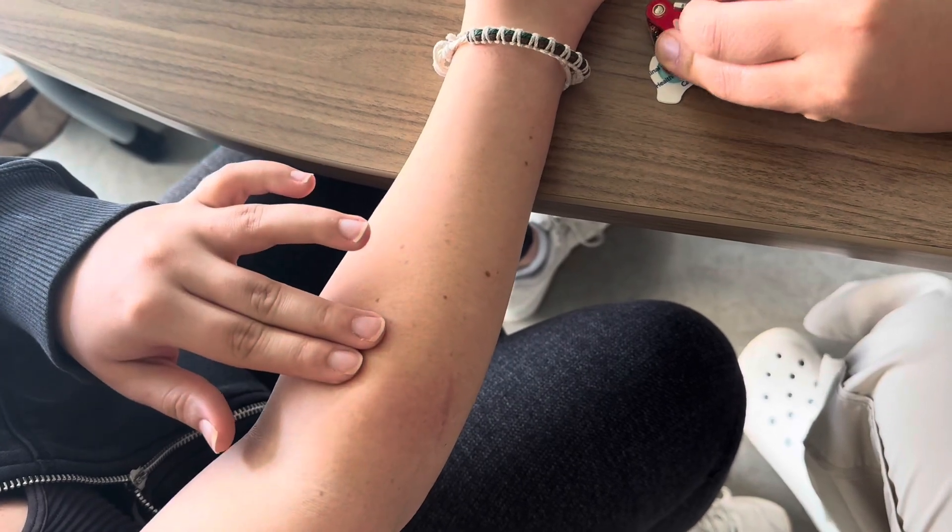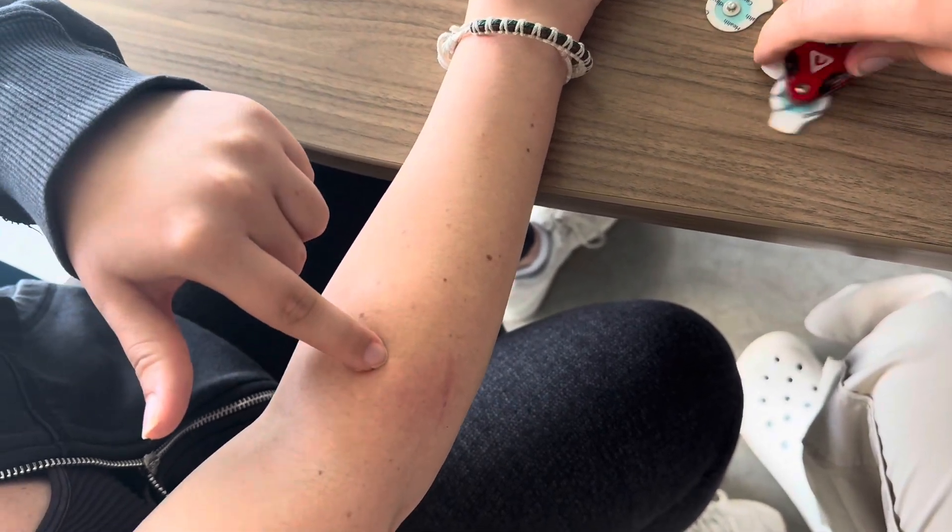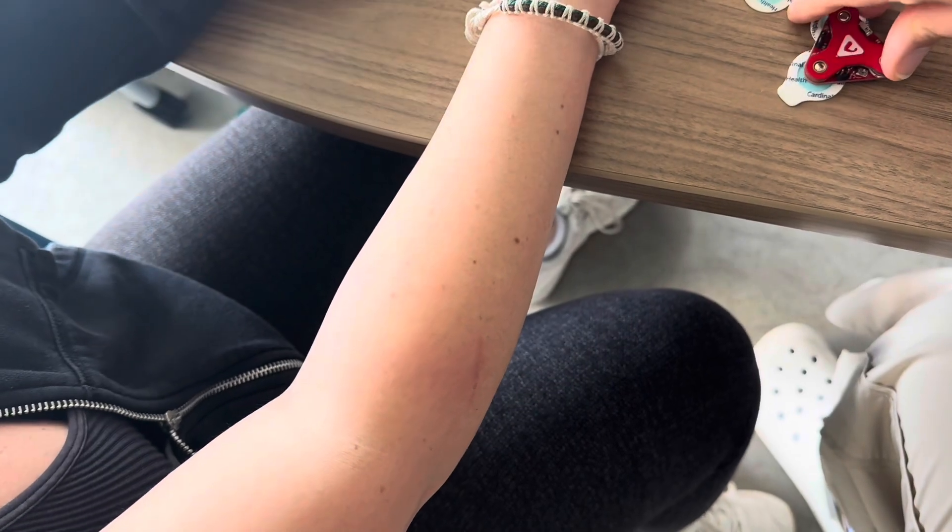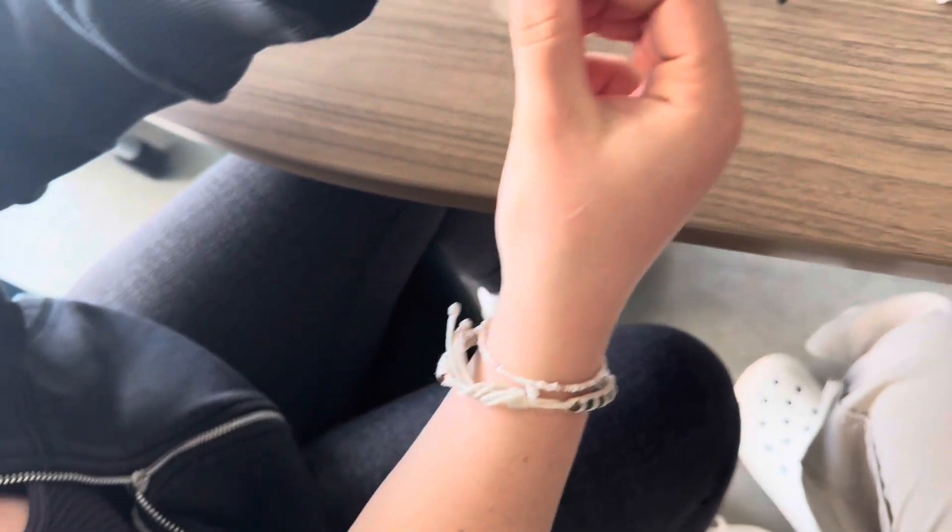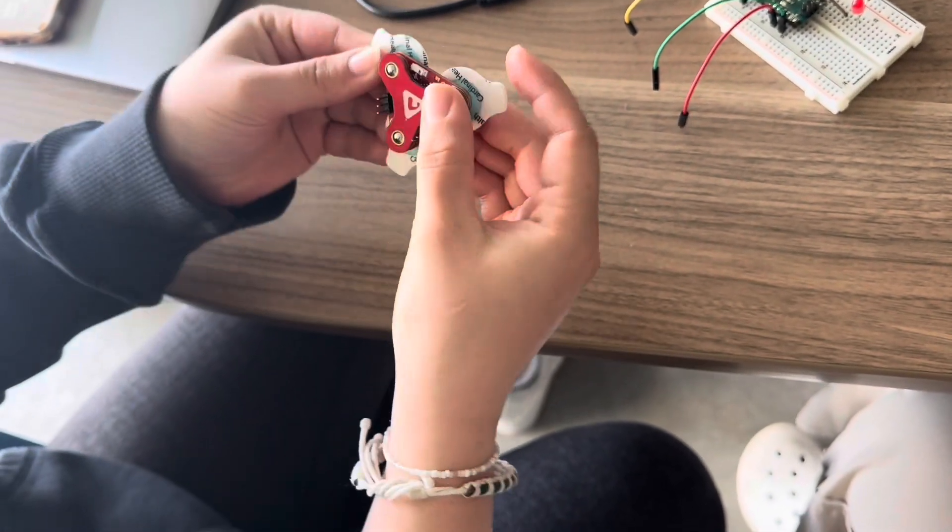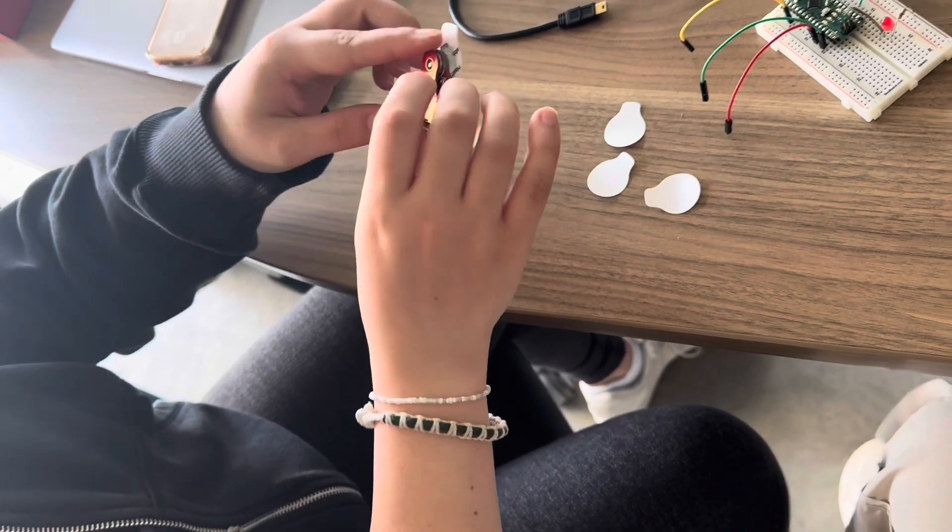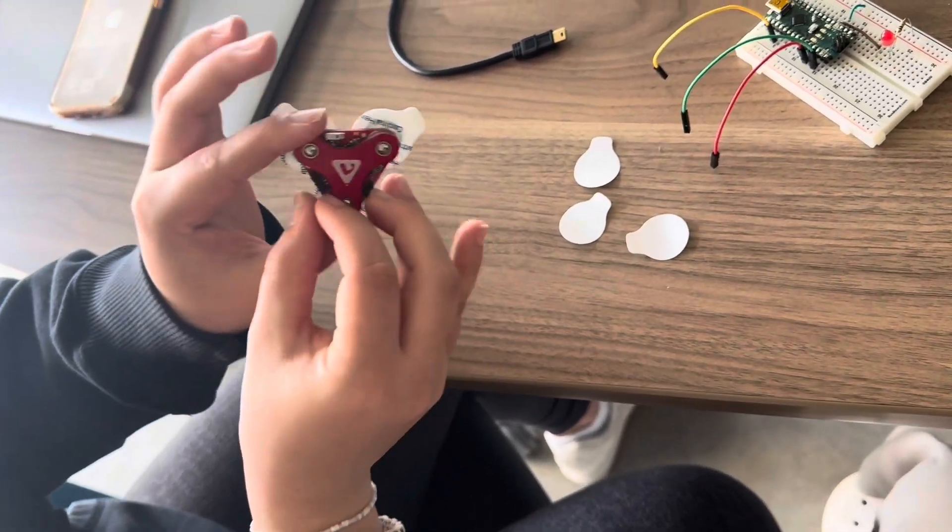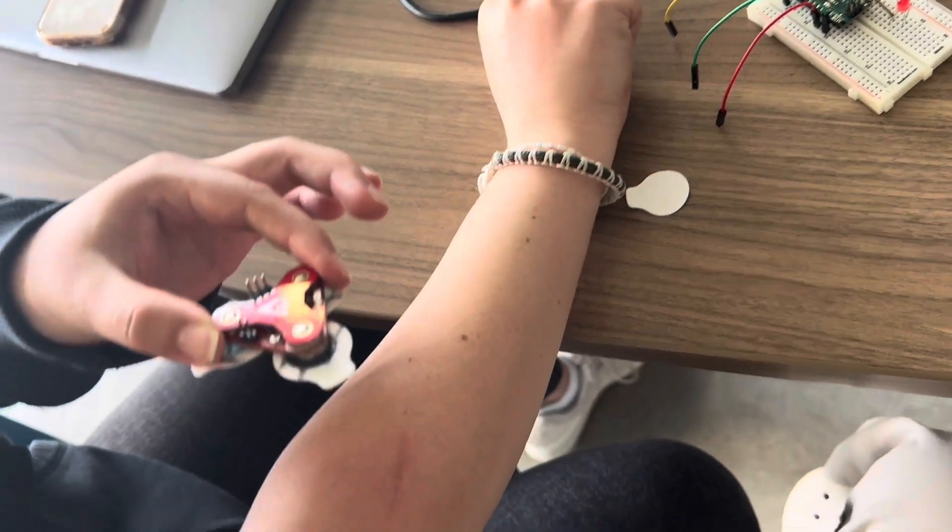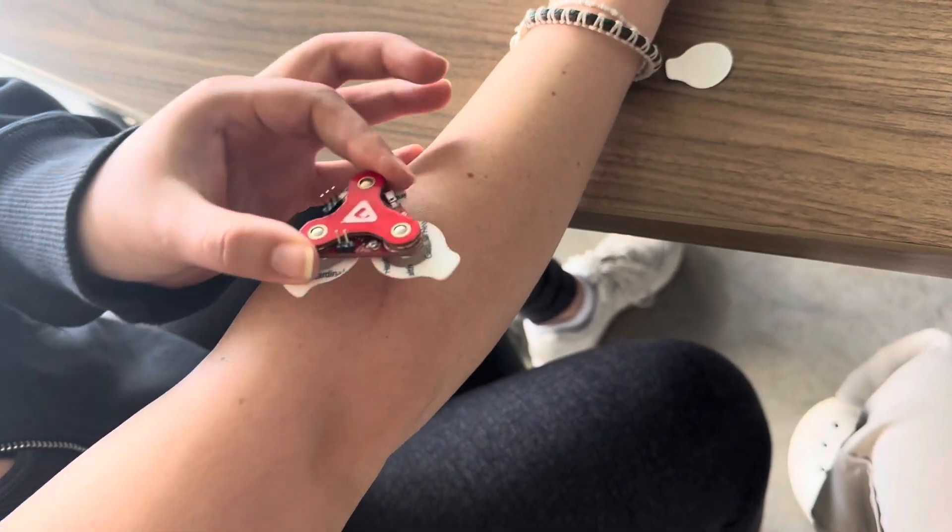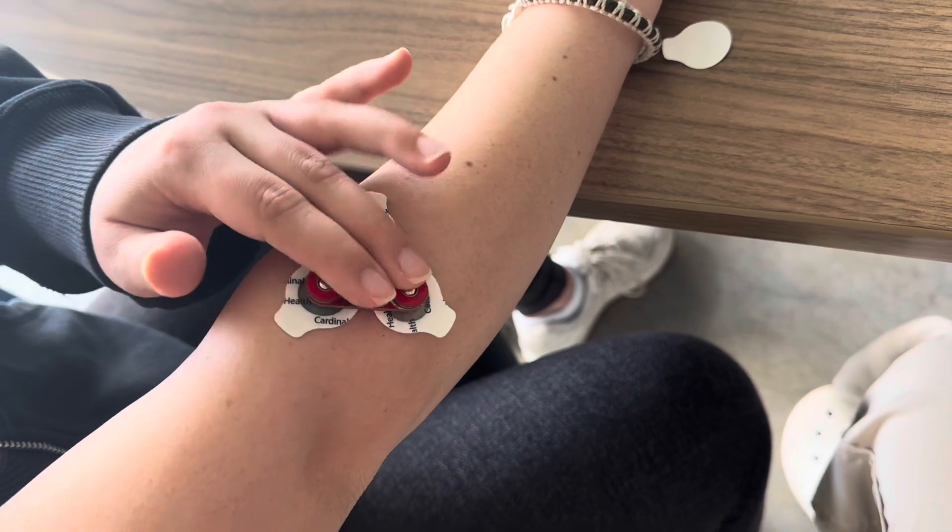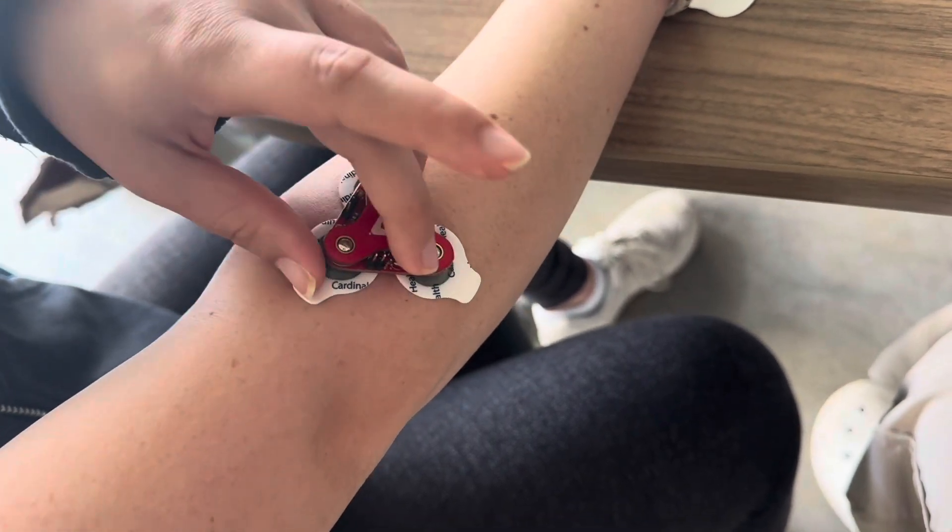Now we're looking for a good spot for the electrodes to be placed. As you can see where my finger is there's a good muscle contraction happening there. Then you place the electrode pads onto the EMG facing outwards. You have to make sure you apply the EMG sensor with reference facing out. Now it's on the place where you could see a good contraction.